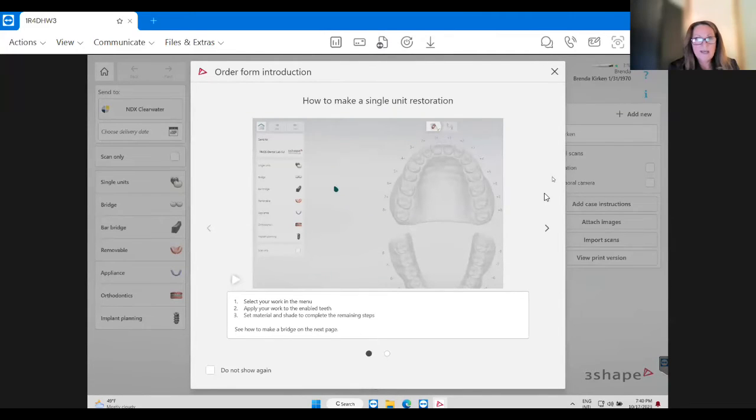When you're scanning on an upper, the palate, the lingual side of an upper denture, it is a lot of times so smooth and shiny that scanners have a hard time capturing it because it's reading it as the same area. So I just do it automatic now because there have been so many times I've had to stop my scanning to put a little flowable on the palate.